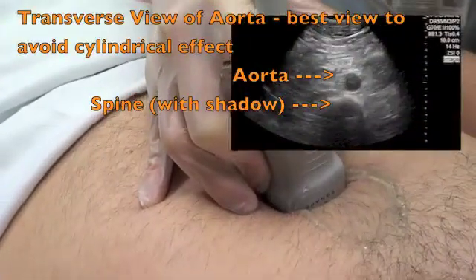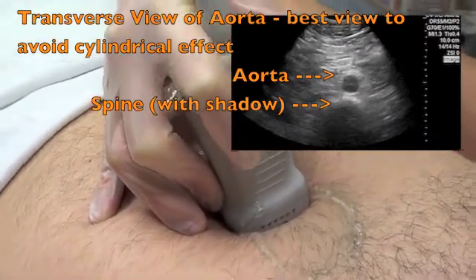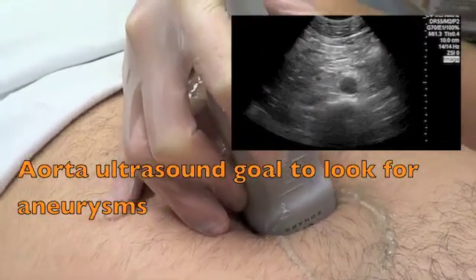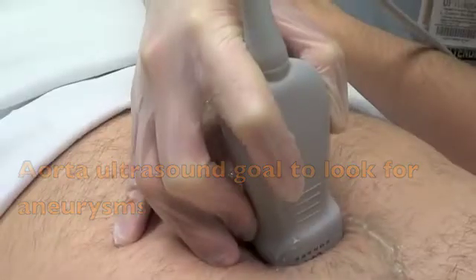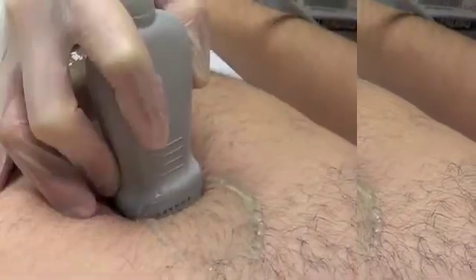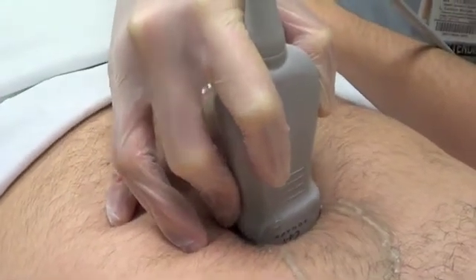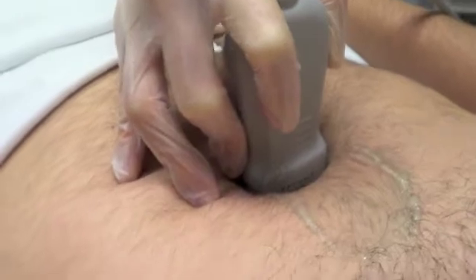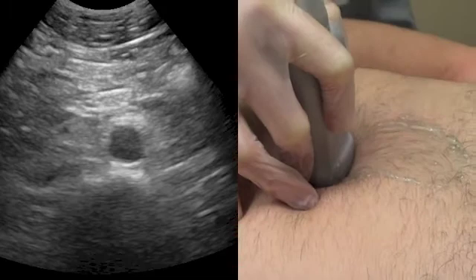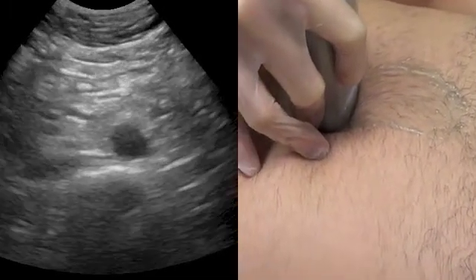We're going to find the aorta. This gives us the best view of all the walls of the aorta because we want to make sure there's no cylinder tangent error, where you could cut the aorta in different slices and actually underestimate the size of it — if we're looking for aneurysm, which is the main reason we're doing this ultrasound. We want to follow it all the way down in the midline. Sometimes bowel gas will get in your way and you'll lose it — to get rid of that, you can apply firm, steady pressure, and sometimes that will bring the aorta into view better.